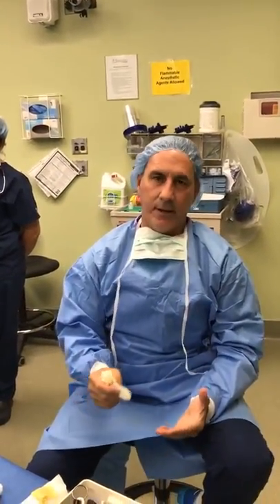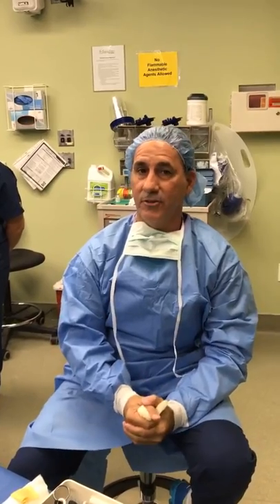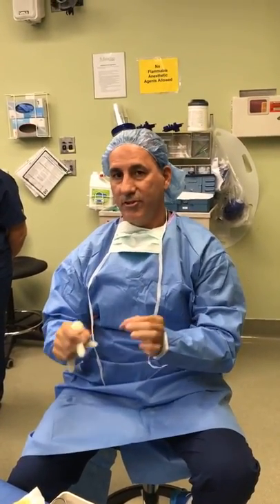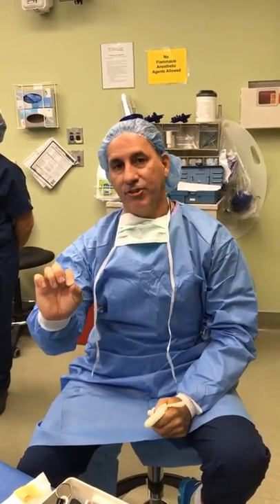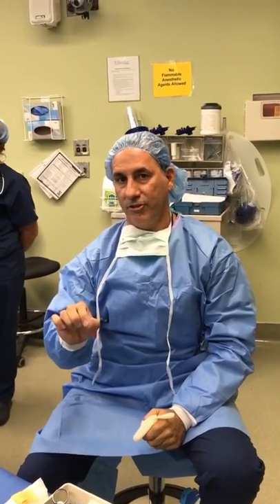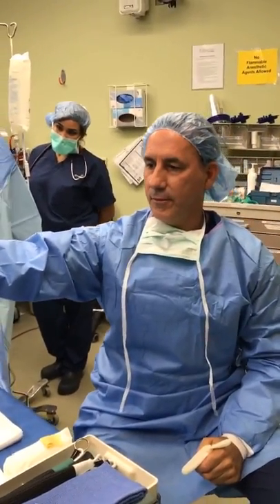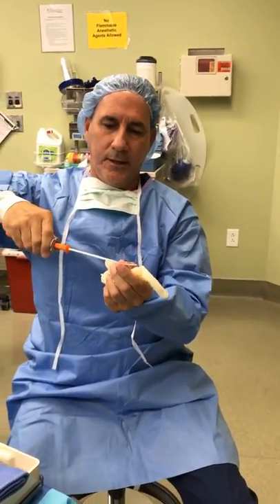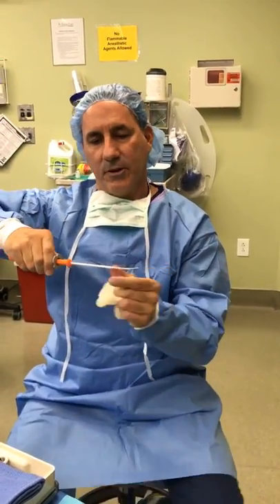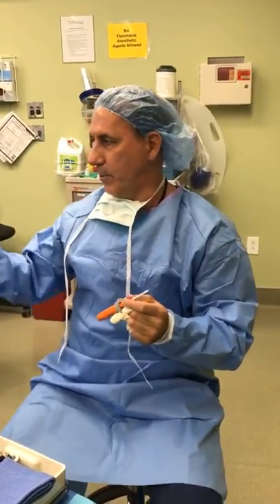So what you saw here was not only a way to diagnose what has been causing this young guy's wrist pain for over 10 years, but allowed us to make the diagnosis, in this case a TFCC or a cartilage tear, peripheral, the edge, clean it up, and actually repair it all inside without having to make additional incisions with the technology. You see the TFCC repair? Yes. Okay. So this sharp device went in, and I was able to deploy these little bioabsorbable anchors almost. I deploy it, push it out, and then tie down the suture. And now we let Mother Nature take over, keeping them in the cast in supination for 5 weeks.